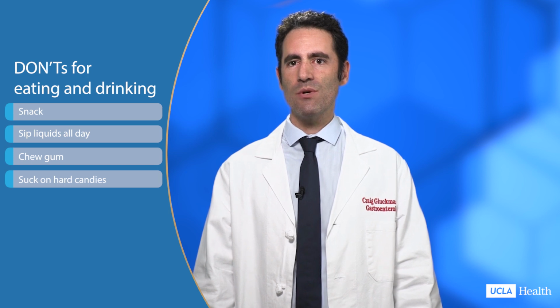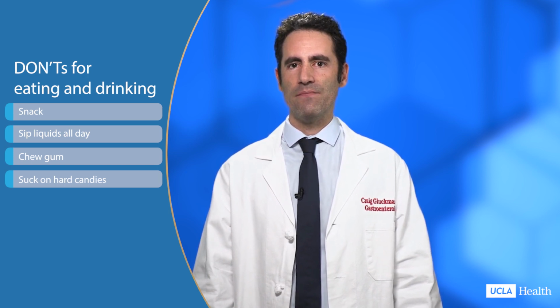Now let's make sure you know the do's and don'ts for eating and drinking during your Bravo procedure. Do: eat breakfast, lunch, and dinner. And be sure to eat foods that normally cause you to have symptoms. Do not snack, sip liquids all day, chew gum, or suck on hard candies during your study.